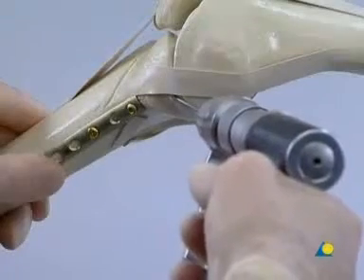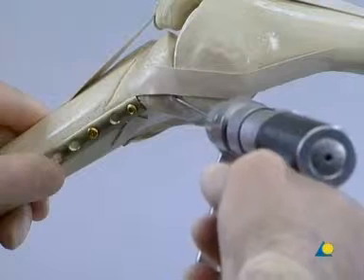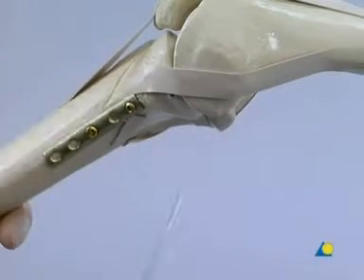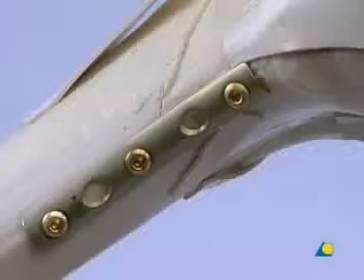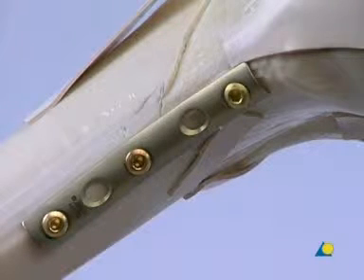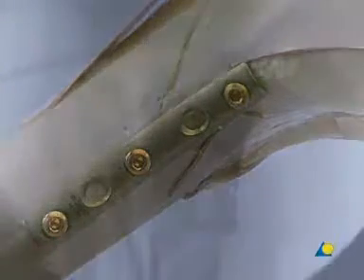The K-wire must now be removed. The third cortex screw is inserted through the most distal plate hole. At this point, an intraoperative X-ray is advisable, as in this clinical example.